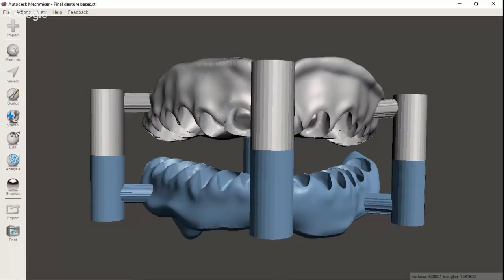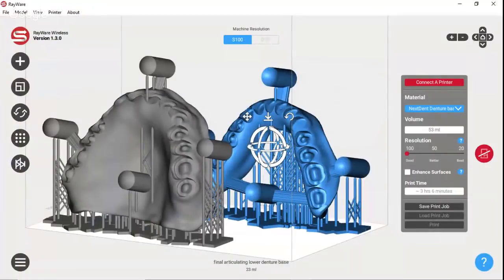Well, this gives you the ability to do the same thing. So you could mount these dentures up in some kind of an articulator, using just this, and then once they've been articulated, pop the teeth in, bond them into place, and then you could come back and now articulate them, check your occlusion, really dial it in if you want to go that geeky. You could also just do a chairside delivery and adjust them like most people do.